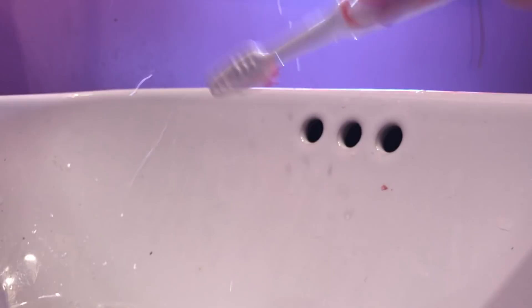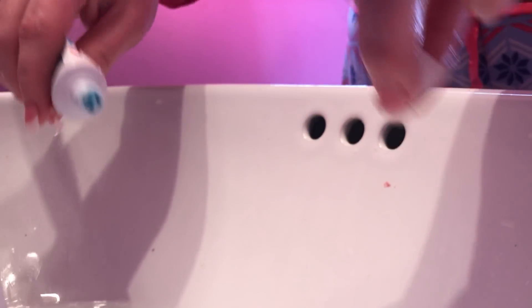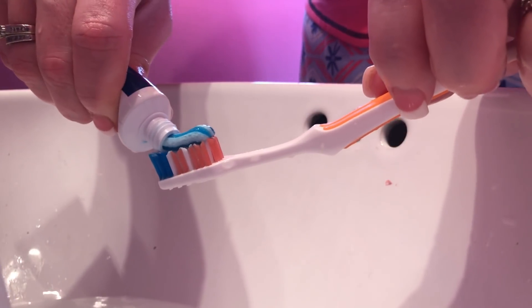Now I'm going to brush my gums — I won't show that on camera, but you know how to brush your teeth or gums. Some people have partials. I just use a soft toothbrush because I don't like medium or hard bristles.